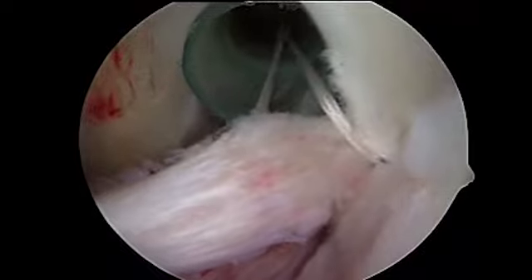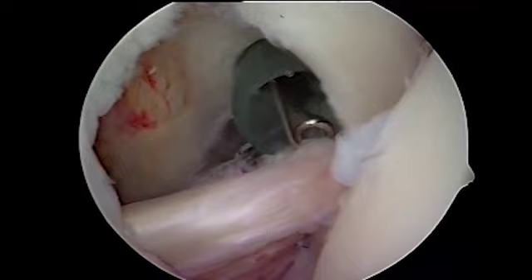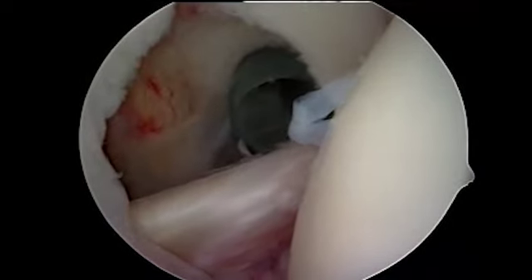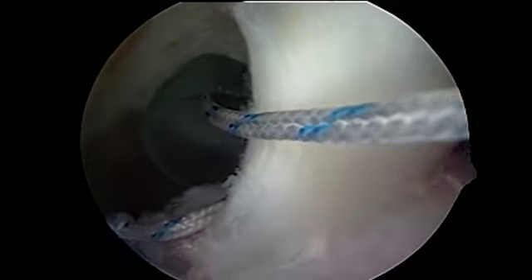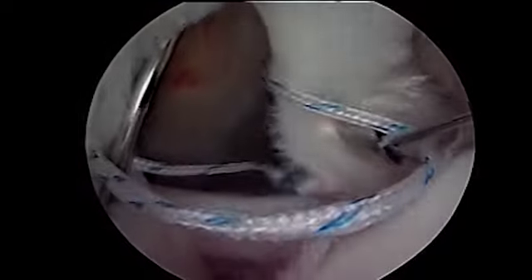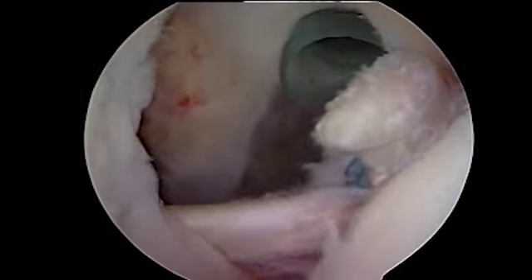Management strategies to deal with the subluxated or dislocated biceps are shown here. One such management technique is to repair the subscapularis as shown here using standard suture anchor suture passage after excision of the rotator interval capsule as shown, but then also repurposing the sutures, which are not cut after subscapularis repair and are simply reused as shown here and are retrieved through the biceps so that the biceps can also be securely tenodesed in the same location as shown.